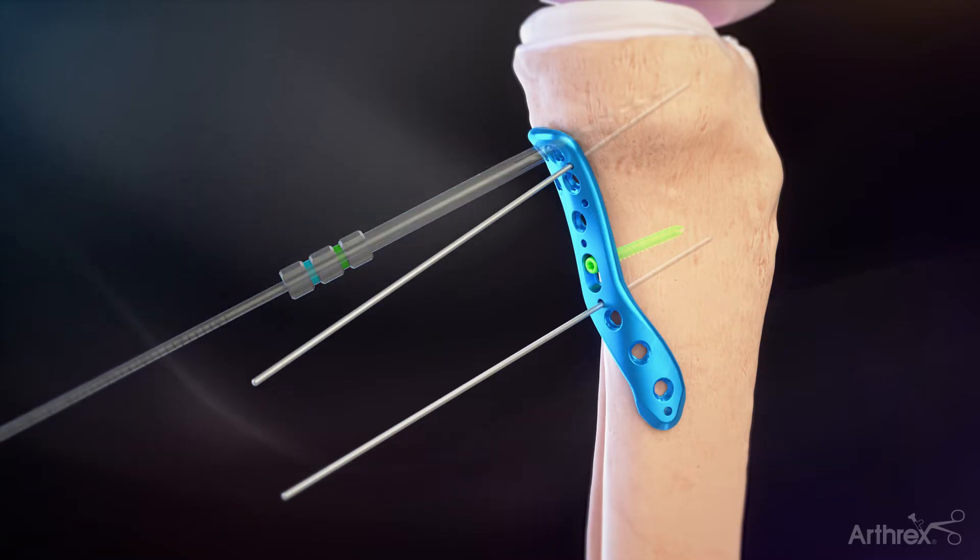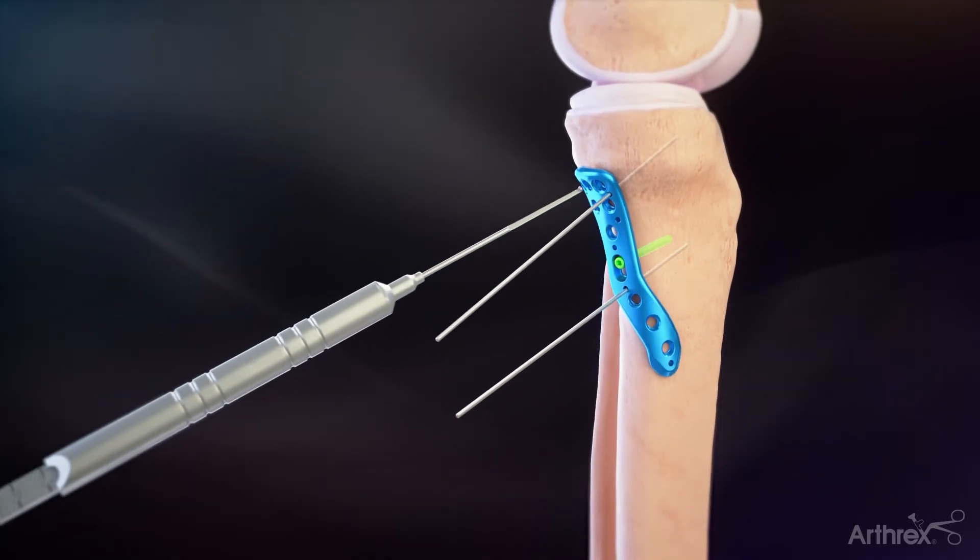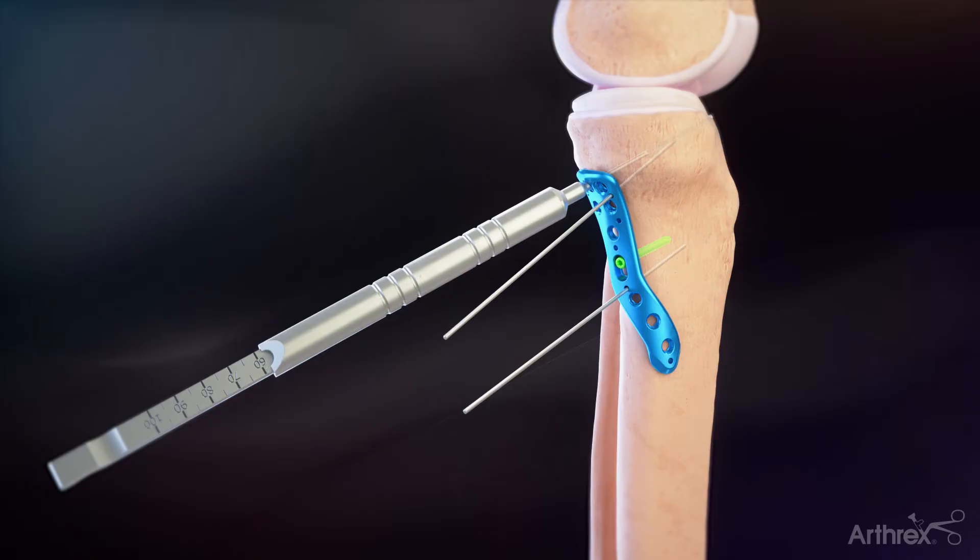Drill through the guide with the 2.8 mm drill and use the calibrations or the hook tip depth gauge to determine the screw length.